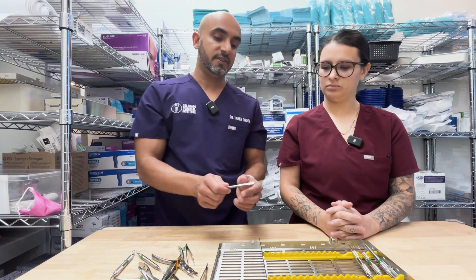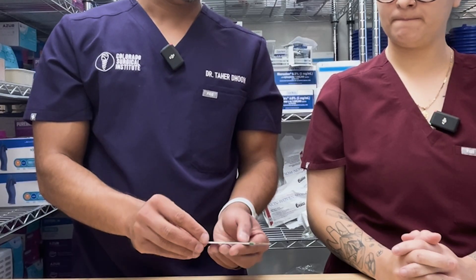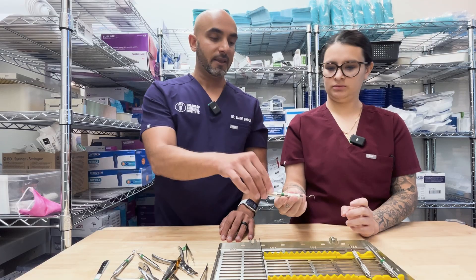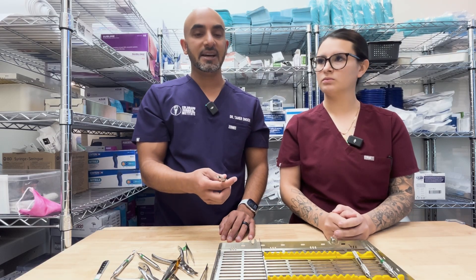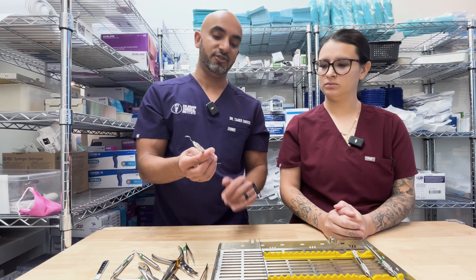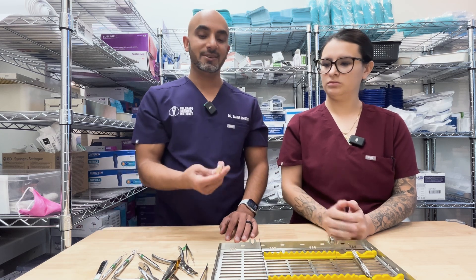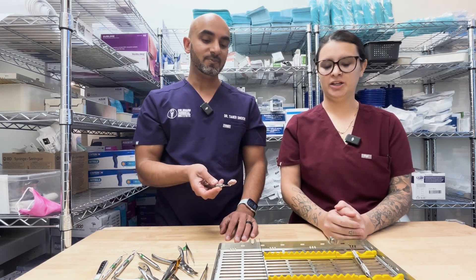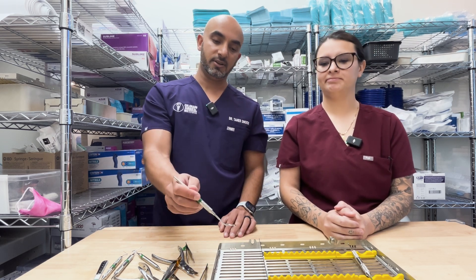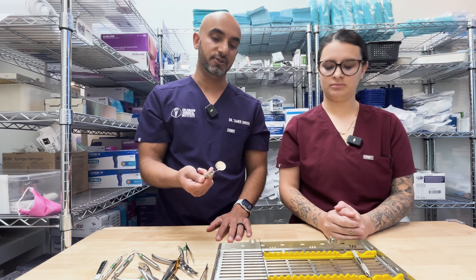For the 15 blade scalpel, you could have one or two — we go through about two to three 15s per procedure. I rarely use a 12. The perio probe and explorer: I think it's nice to have the perio probe every once in a while to take quick measurements — good to have in every single kit. By the time you run your surgical kit a couple of times, these get bent from prying in different places, but they serve their purpose. As for the mirror — I don't really use a mirror in surgery. Maybe the only time is going into the sinus to check if the membrane is intact. It's very infrequent, but we stock it in every kit.